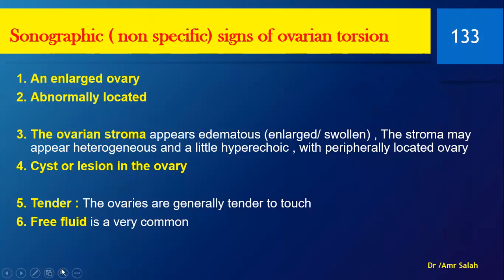Then the free fluid, the tenderness by the probe. She cannot tolerate the probe, and the free fluid. These are very important.